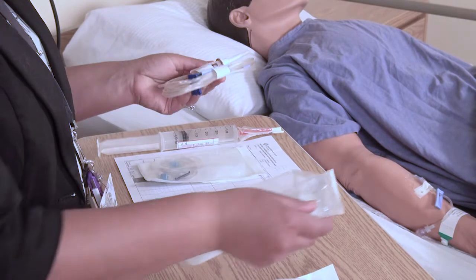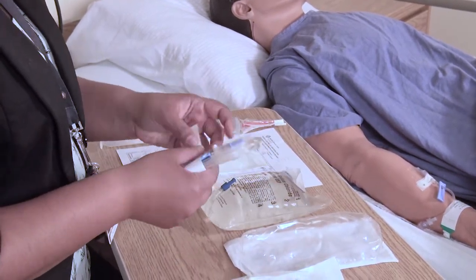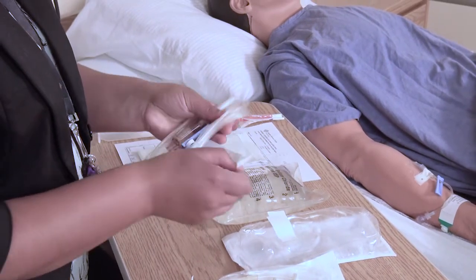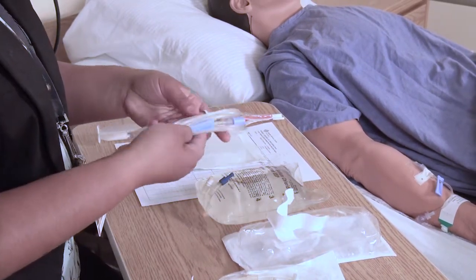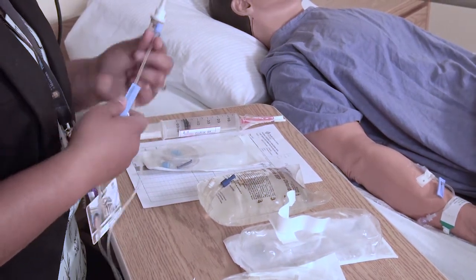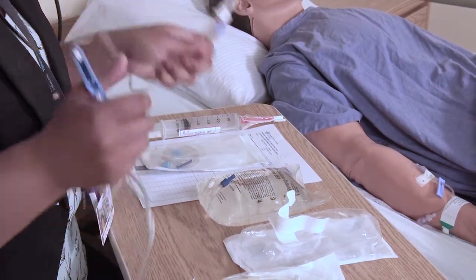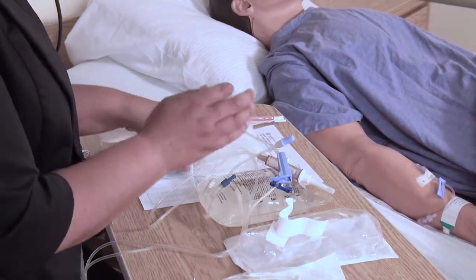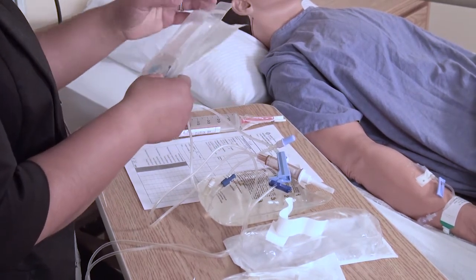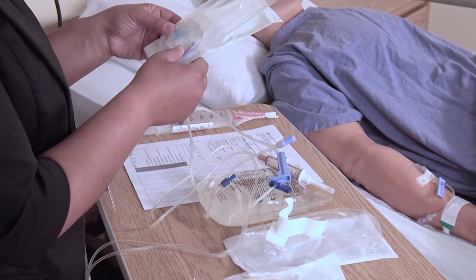You want to prime your carrier with normal saline because it's one of the medications that is compatible. Then we'll attach it to the PCA tubing. So you want to make sure you prime everything. Aside from this, you also want to make sure that you're priming your PCA tubing with the medication. Just be really careful about that so you don't waste medication.